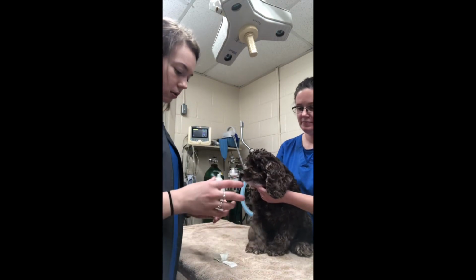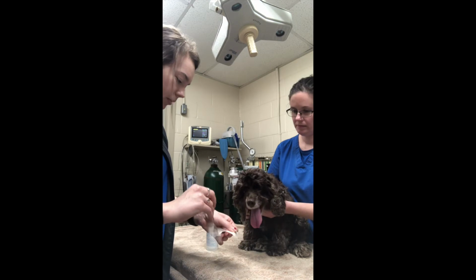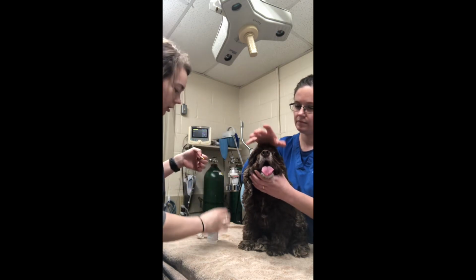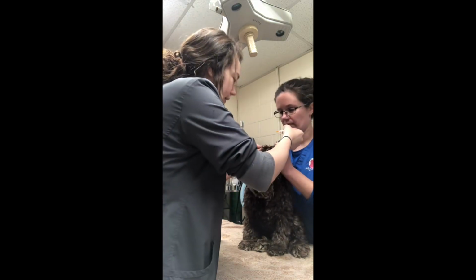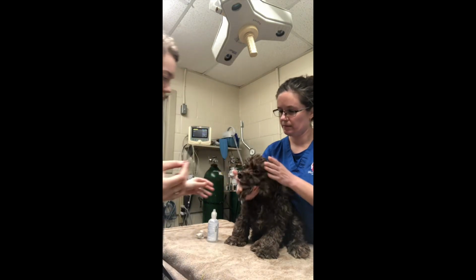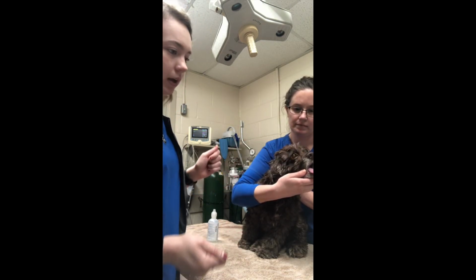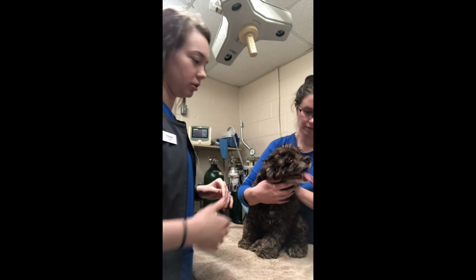Okay, now we're going to do the corneal staining. I have a sterile strip here. I'm going to use this ophthalmic solution to moisten the strip. And you can either touch the conjunctiva, being careful to avoid the cornea, or you can just let it drip onto the eye. Okay. And then we're going to let her blink a few times, or if they won't blink, we'll just gently open and close the eye. And then we're going to use an ultraviolet light to check for any abrasions or any break in the epithelial surfaces.